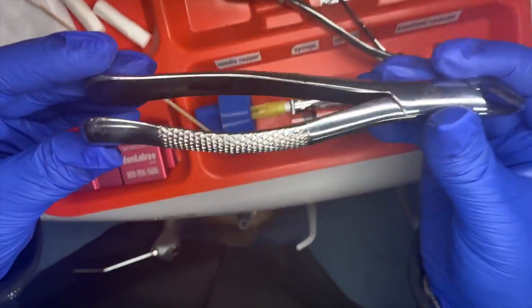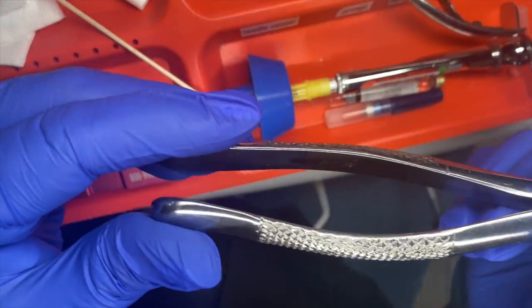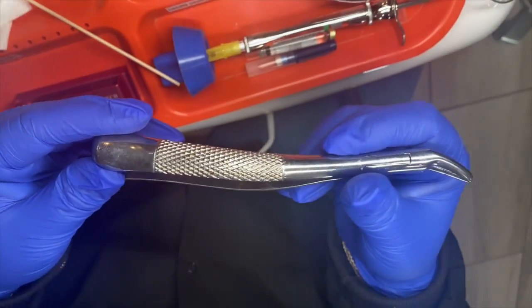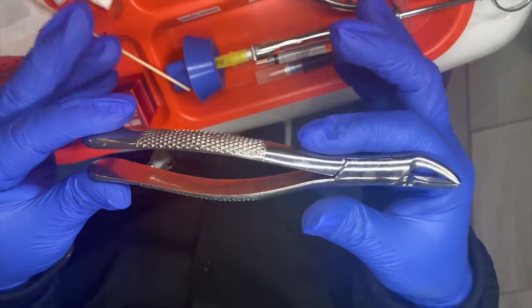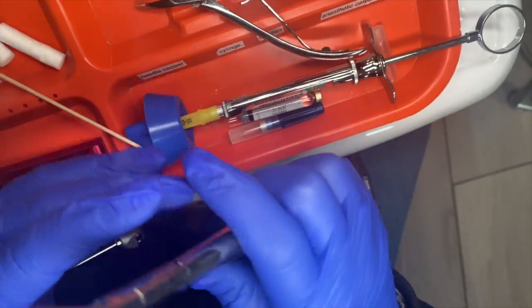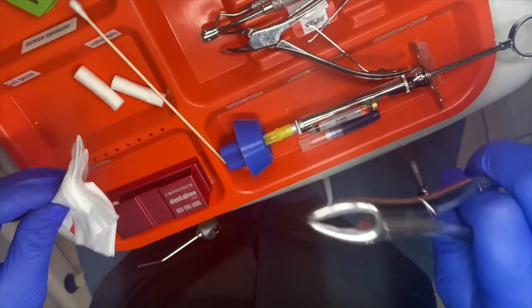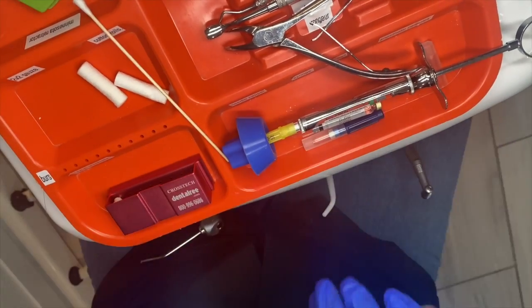These are forceps. This is actually a 150 — there's a 150 and a 151, and they're all used for different types of teeth: maxillary, mandibular. We give it to the doctor, we'd have cotton in our hand, the doctor would extract the tooth, and we would take this with us.